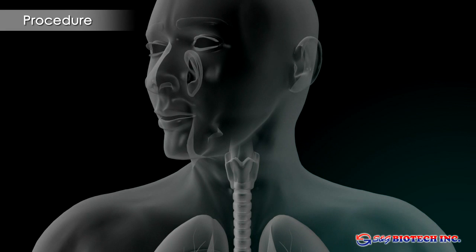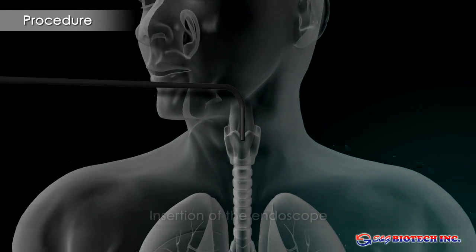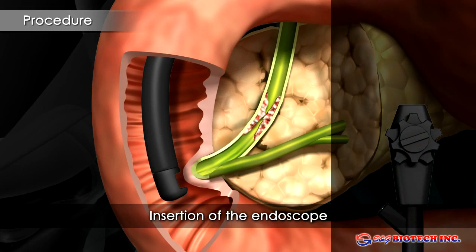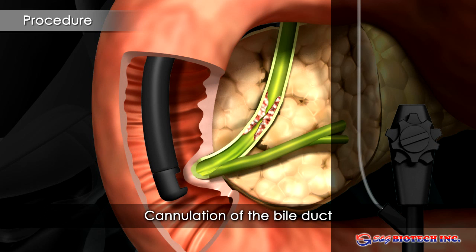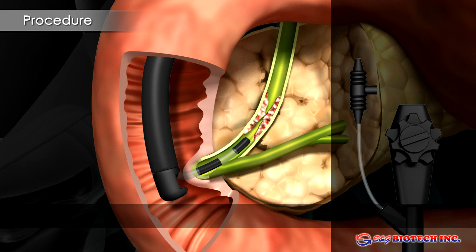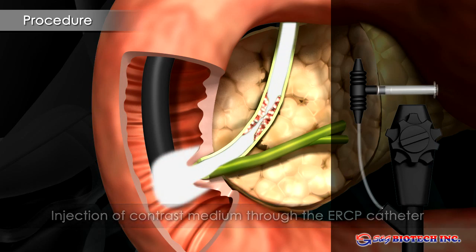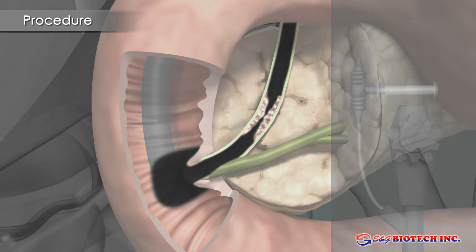The endoscope is passed into the duodenum and the major papilla visualized. An ERCP catheter is inserted through the endoscope and the papilla cannulated. A contrast medium is injected to demonstrate the position and length of the stricture.